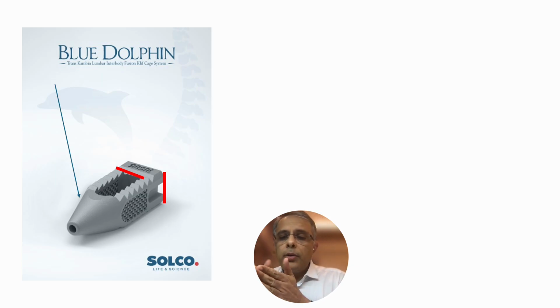When you are inserting the conical tip inside the disc space, it will gradually expand its way so that it will open up the end plate. And not only that, this conical tip will push the ENR away while the cage is getting inside the disc space, making it a very safe entry. This is the only cage available in India, to the best of my knowledge, where we have provided a very long conical tip for the cage to go inside the disc space very easily.